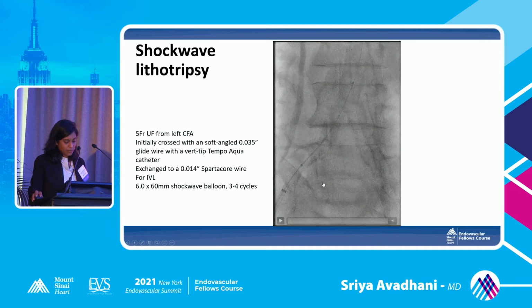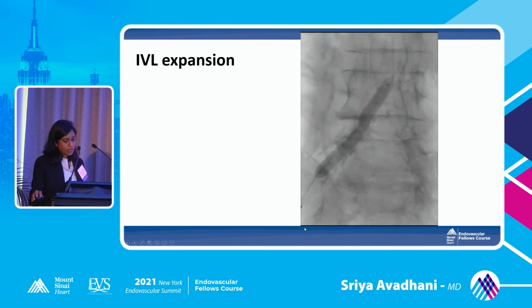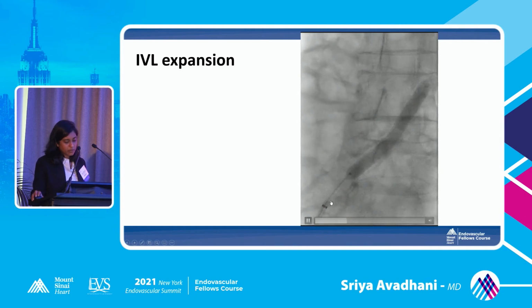Let me save this video. And as you see, as the balloon goes up, there's a tight waist where it doesn't. And after about 3 or 4 cycles, we got good expansion of the shockwave balloon.